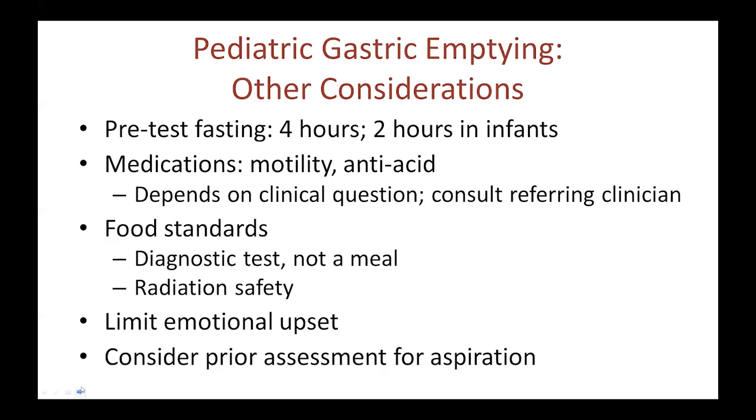Recently, there's been concern about applying food standards to preparation of the standard or alternative meal. And although we want to be safe, it's also appropriate to remember that this is a diagnostic test and not a meal. It's also appropriate that applying food standards not affect our ability to perform radiation safety. We do our best to limit emotional upset, as this can delay gastric emptying. And in some patients, it may be appropriate to consider prior assessment for aspiration even before performing the gastric emptying study.